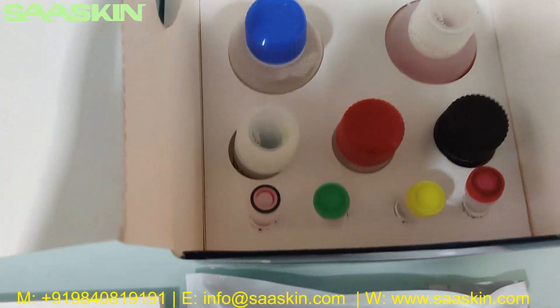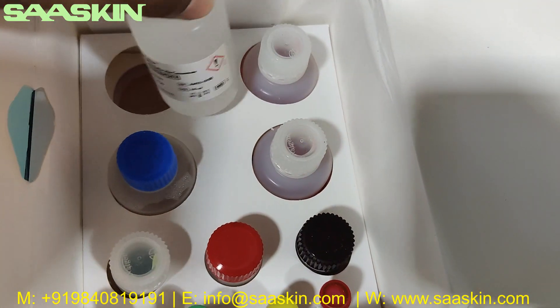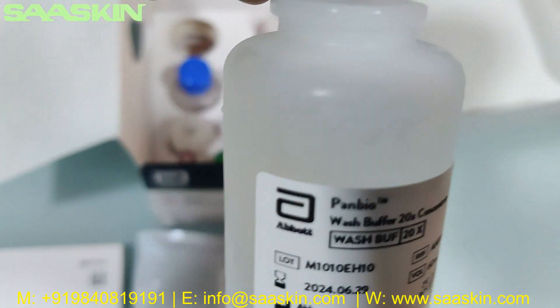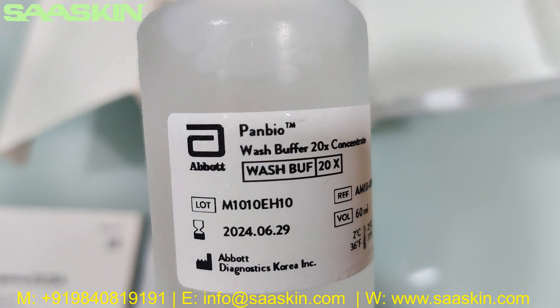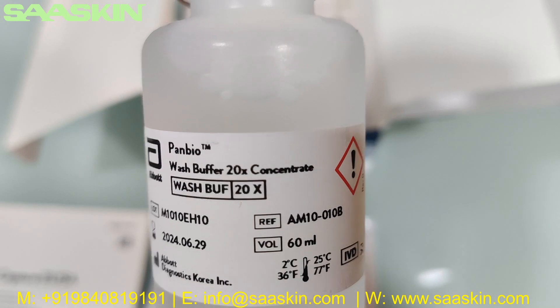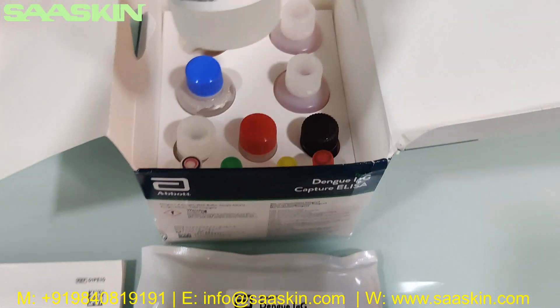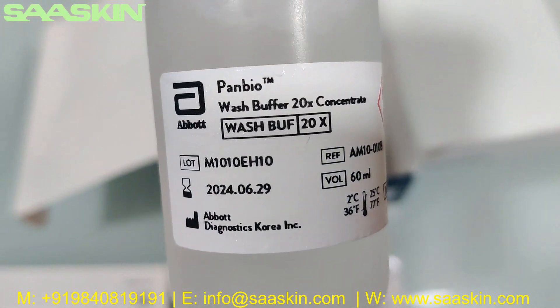I'm going to pull them out one by one and tell you what each is. This is the Panbio wash buffer — 20x concentrate wash buffer. This is the wash buffer we got. I'm going to show you the wash buffer.